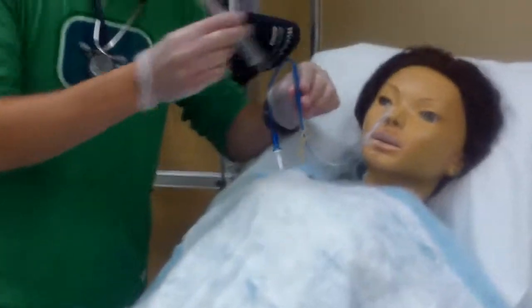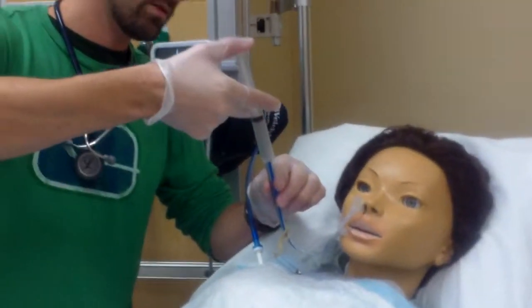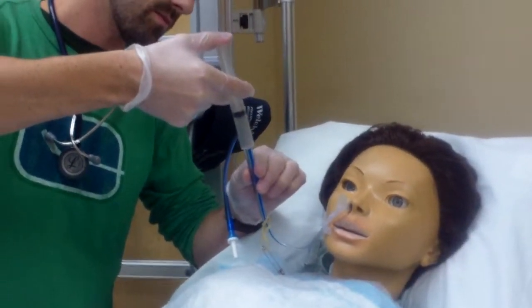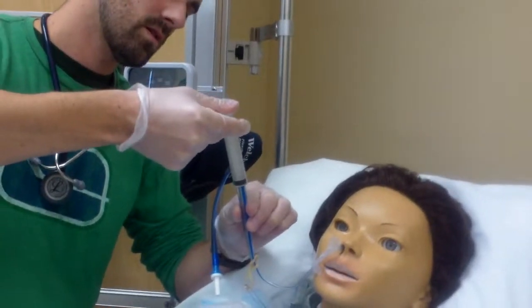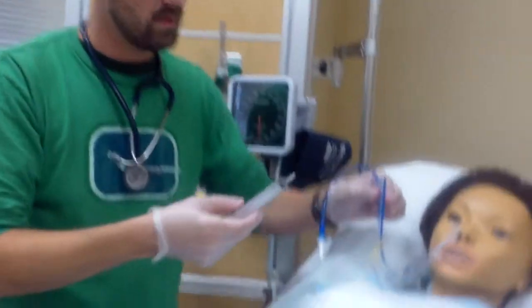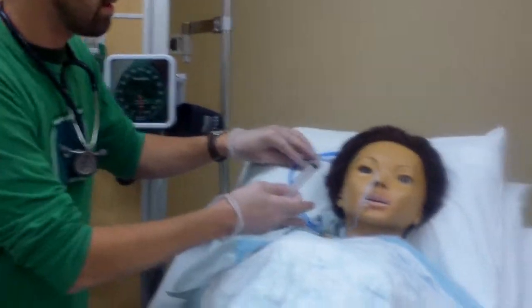And then take this, not pulling on the nares because that's uncomfortable. Slowly administer the medication. Alright, there we go. That's good, it went down.